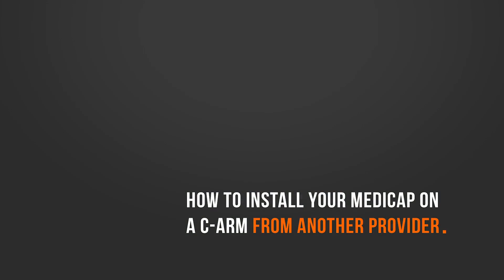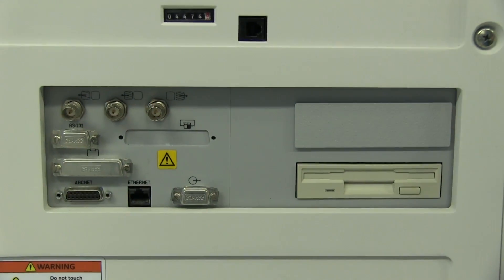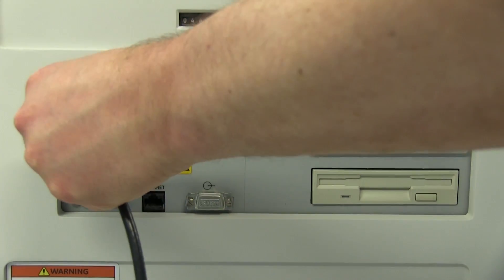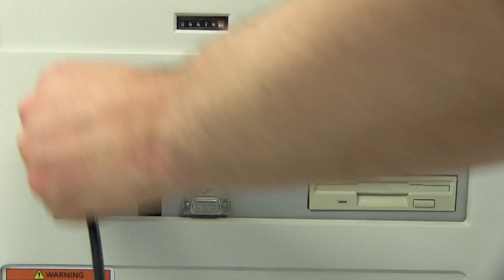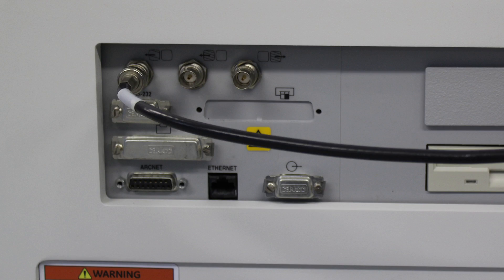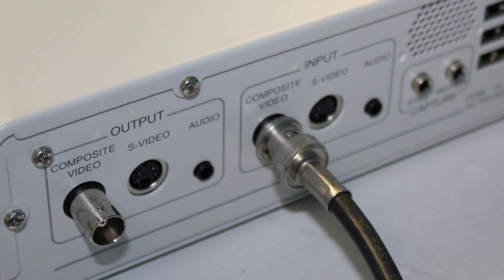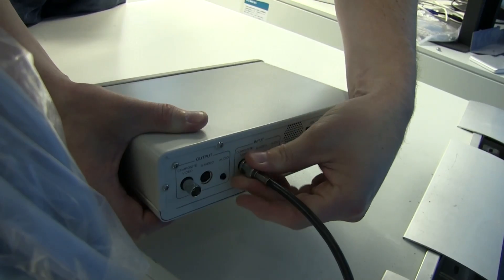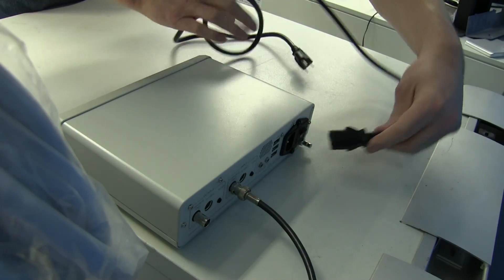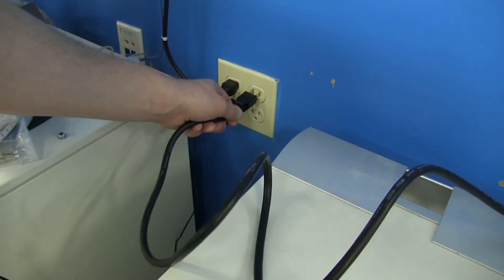If your C-Arm was purchased from a provider other than Block Imaging, the connections to your MediCap device will need to be made externally. Take your video cable, whether BNC or S-video, and connect it to the corresponding external monitor output on your C-Arm monitor cart. The other end can be connected to the video input port on the back side of your MediCap. The end of your power cable can be connected to the three-prong port on the back of the MediCap and plugged into a standard wall outlet.